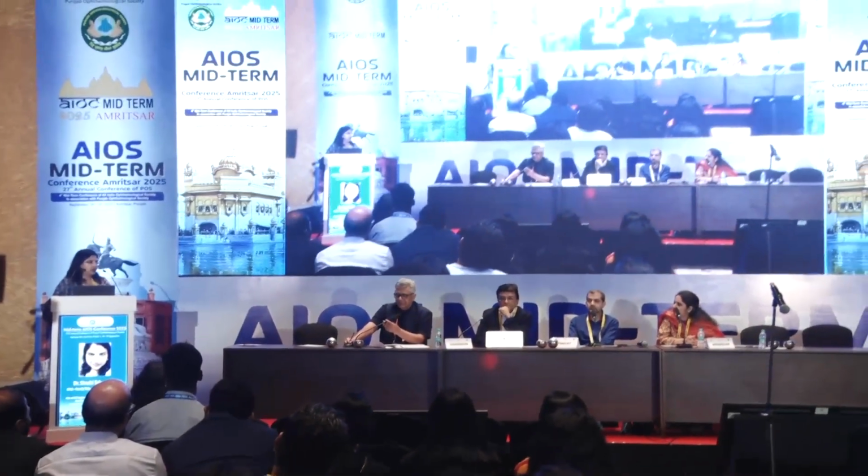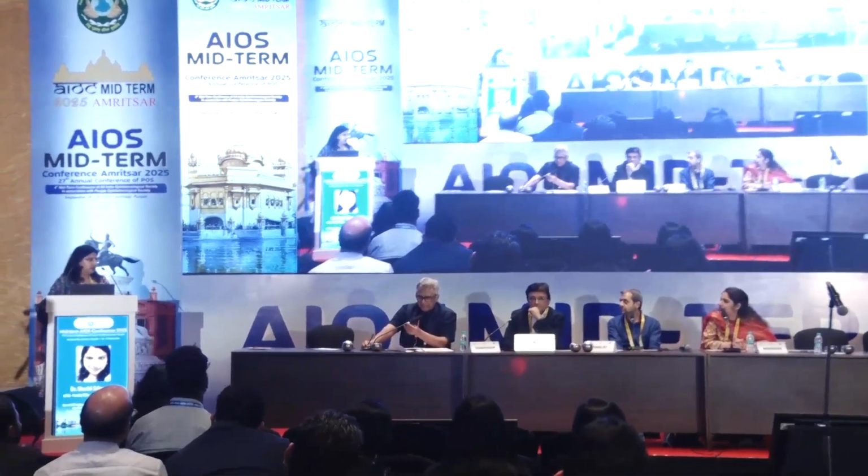So currently, as I told you, we are doing research on this topic. Obviously, we are doing OCTA. But I think it's very beneficial in cases of severe NPDR because it can identify any subtle NVE, and also in those patients who have diabetic nephropathy, where we cannot do FFA. I think it's always better to go for an OCTA.